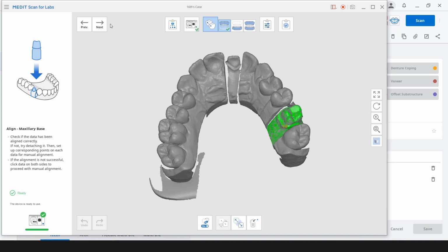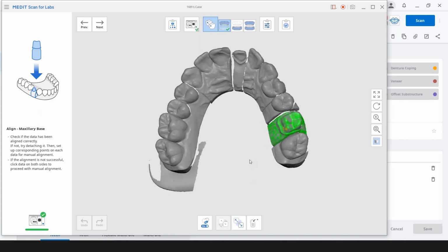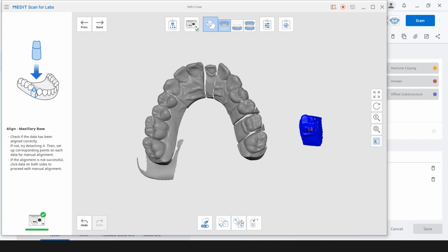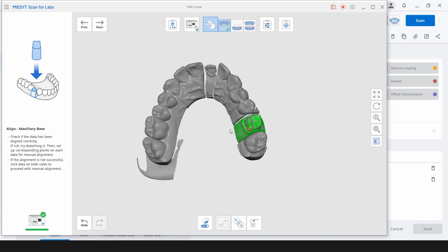Now I won't be doing anything here. That's not me. That's the Medit artificial intelligence actually aligning the 2 scans from the separate die to the model die. And you want to see that marbled look or camouflage look. You can see the tooth numbering there, number 14 here. Basically, this icon just turns it on and off. But if you're not quite 100% sure that it looks the way you want it, as far as alignment, you can use this icon here, detach data. It separates it, and you can use the one-point matching system. So if I go right into the central fossa, right in that groove, in the pit, same place, it lines up and you're happy with it.